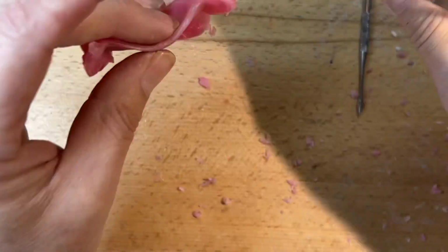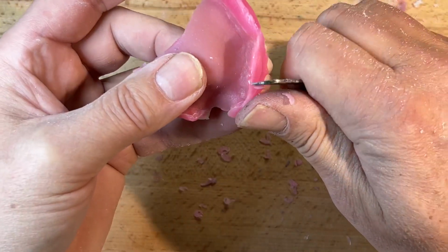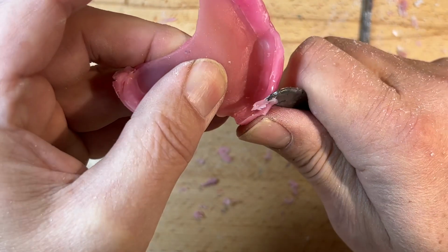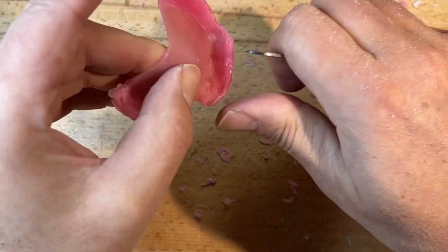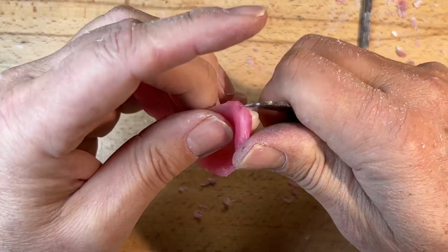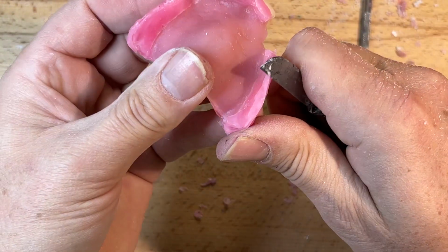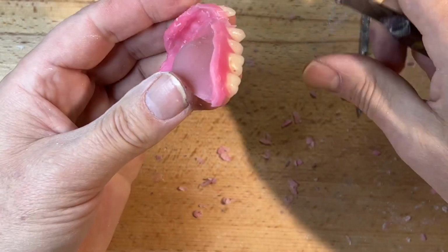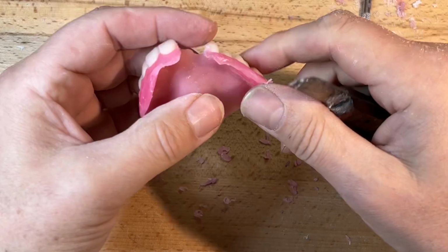I'm going to go and shape the flanges, also keeping in mind how much lip support. These flanges theoretically are replacing the amount of bone that was lost. We're not going to do a big Botox support job here, but you can. If you start to over-exaggerate the neutral zone with the denture base, again, you're creating instability.